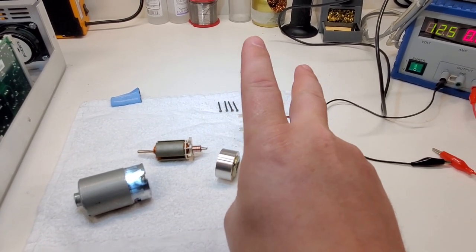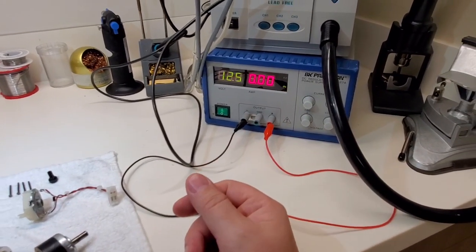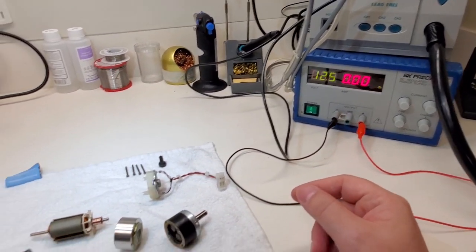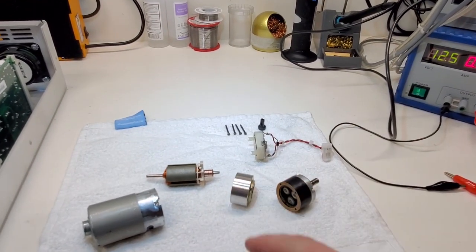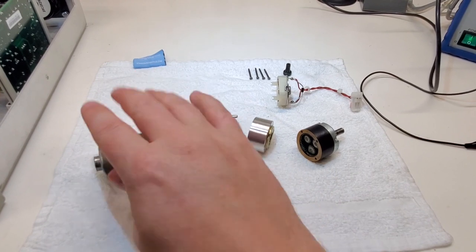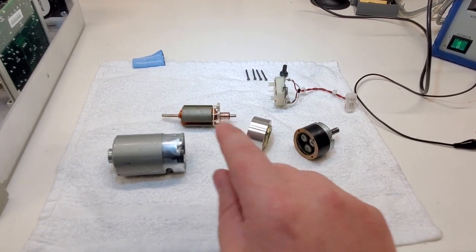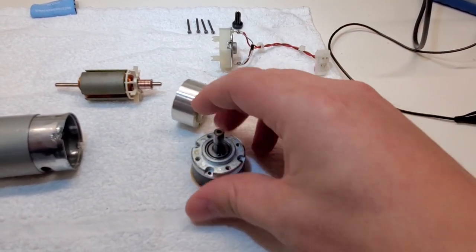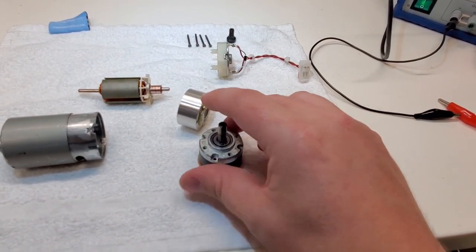So as voltage decreases, amperage goes up, which is why I was diving down to a low 3-4 volts, but I was pulling like 3 amps worth of current. I was pretty much maxing out this power supply because there's an inverse: the lower the voltage, the higher the current, because there's still the same amount of load. Well, it's the same thing with revolutions. If I need to get a lot of torque out of something, I have to decrease the amount of revolutions. So at one end, you spin it really fast, and at the other end, through planetary gear reduction, you spin it slow, and it exponentially increases the amount of torque at the output shaft.